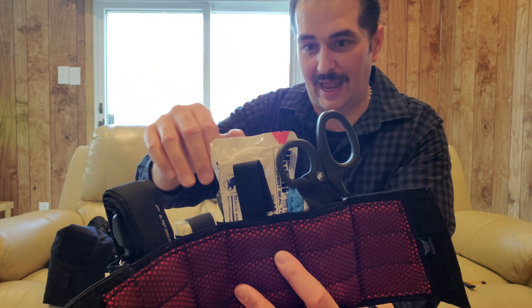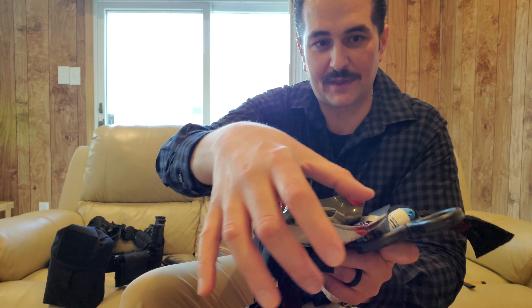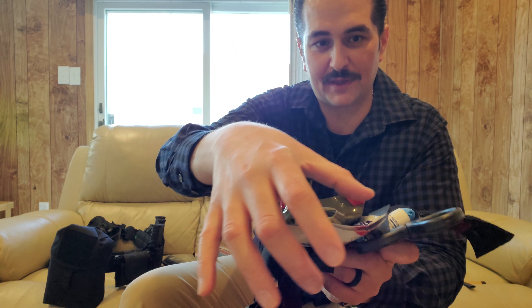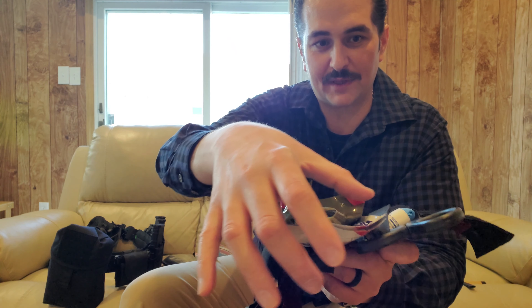It did not come with these compact chest seals — I bought those separately. They kind of fit and kind of don't; I had to bend the packaging a little bit to get them in there. The seals themselves I can feel are not compromised — they're still flat — I just had to fold the wrapper on the sides slightly. But I carry this with me every day.